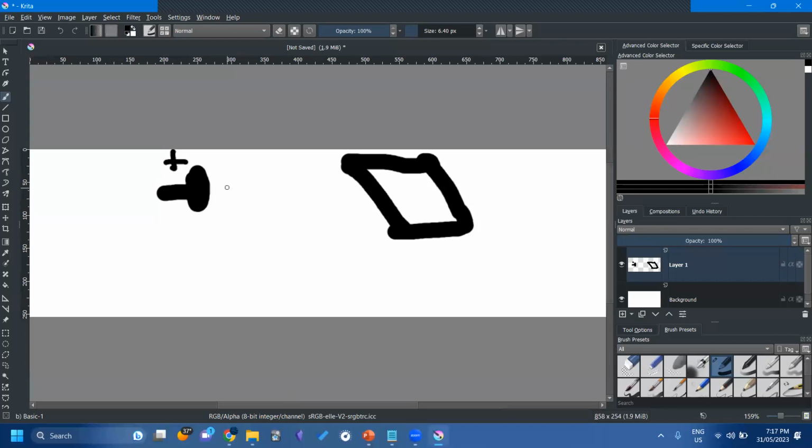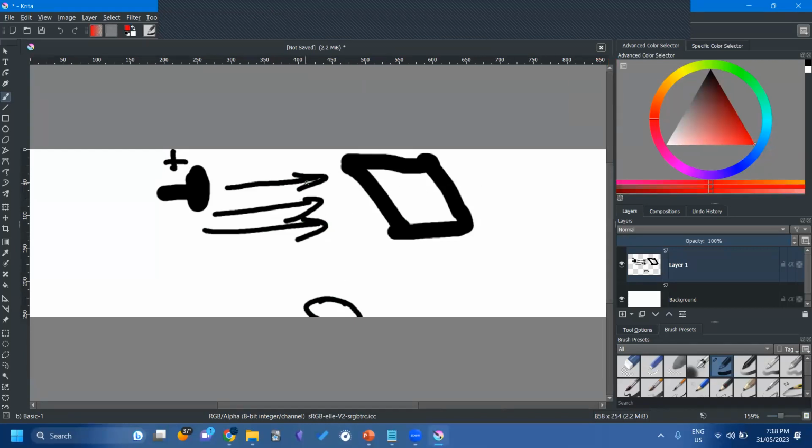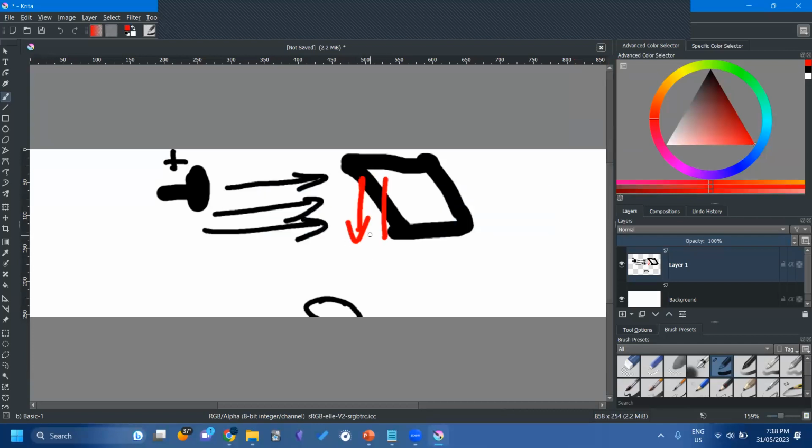Okay, so you're going to have these electrons that are traveling through. Now the key thing is that your detector is going to be over here, right? So anytime these X-rays, let's have those in red, want to travel, they're going to have to travel in this direction.